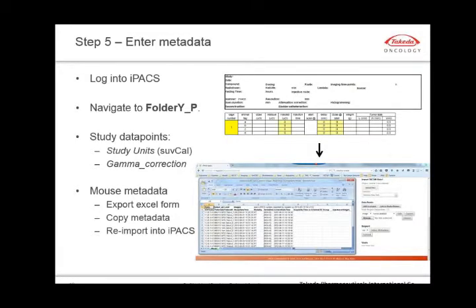Before we start drawing ROIs, we need to enter the metadata, which was captured during acquisition in a separate Excel spreadsheet. We export a spreadsheet from IPACS from the underscore P folder — the tumor analysis spreadsheet — copy that data in and re-import it, and it will automatically assign each metadata point to the appropriate image. At the study level, we enter the SUV calibration factor to get quantitative information, and we also modify the gamma correction to allow clearer visualization of the images for the data selection and visual QC step.